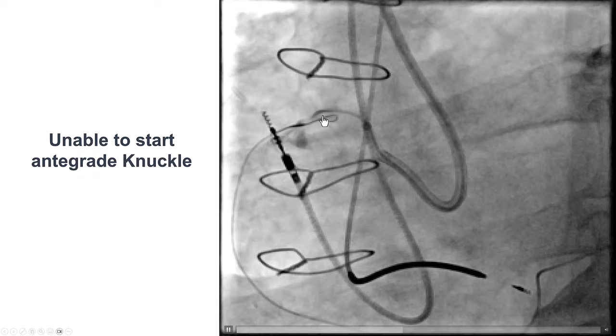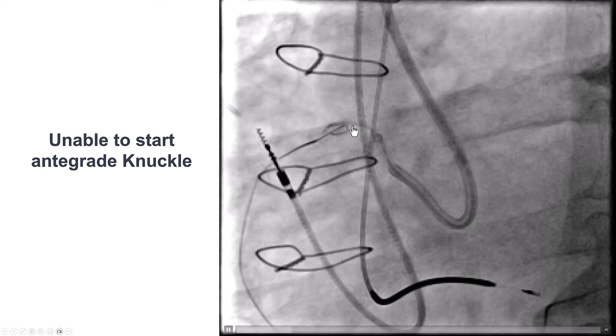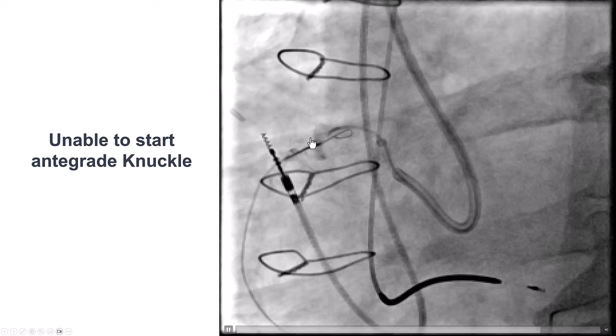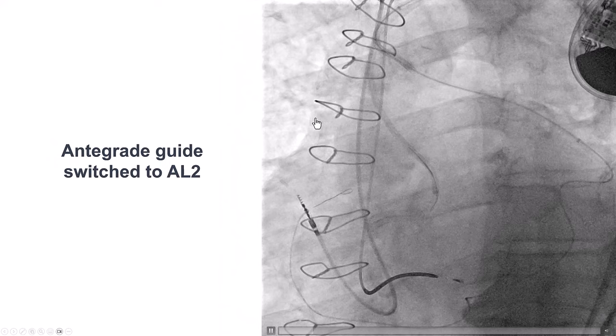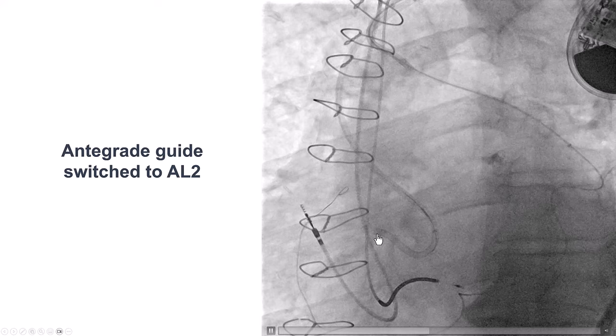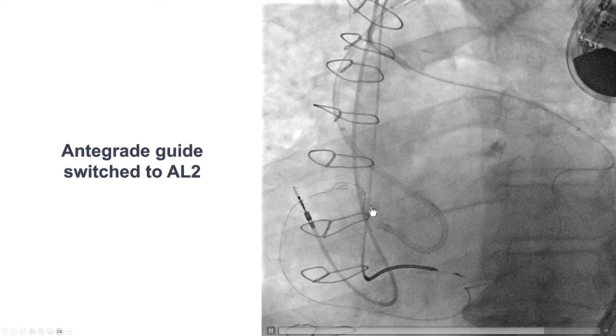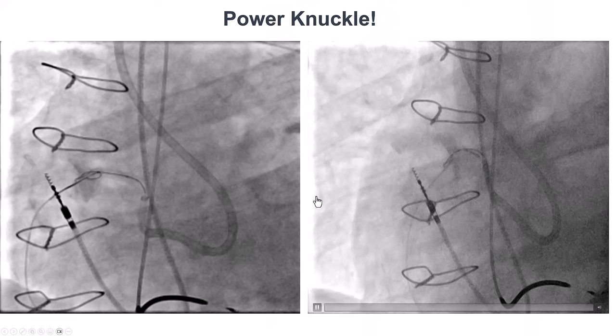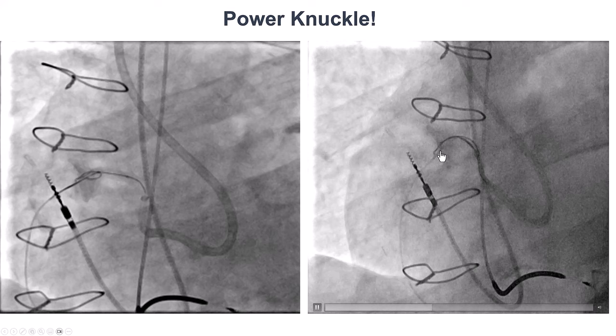We were now trying to get an antegrade wire into the extraplaque space and then do the reverse CART, but we had a lot of difficulty advancing the wire into the extraplaque space. We changed the antegrade guide to get more support — similar to the retrograde guide, we used an Amplatz Left 2, which is more supportive than the Amplatz 1. There was again a lot of difficulty engaging, though we also had a guide extension and were finally able to get some penetration and advancement into the vessel.